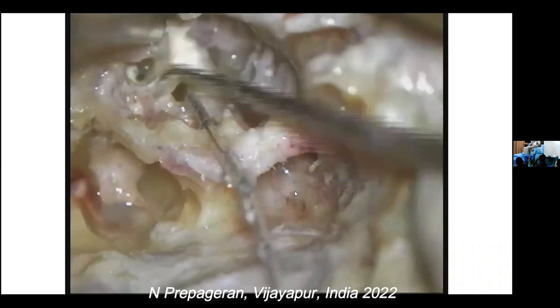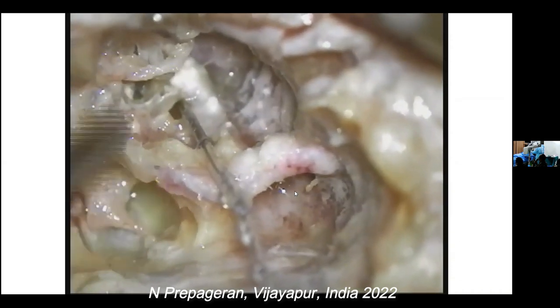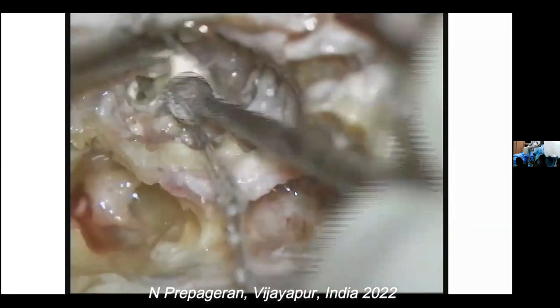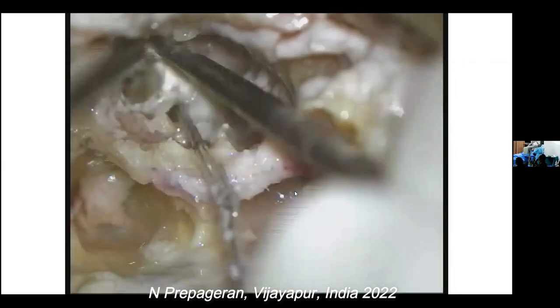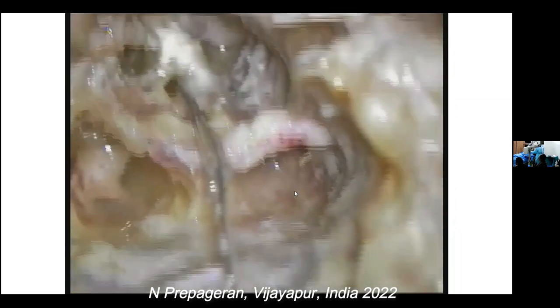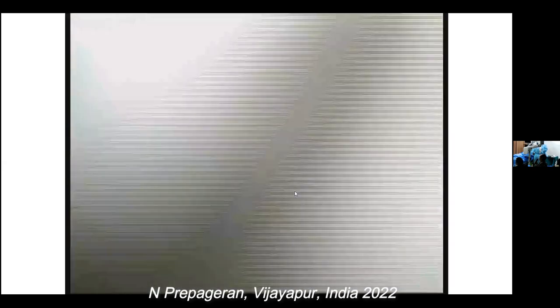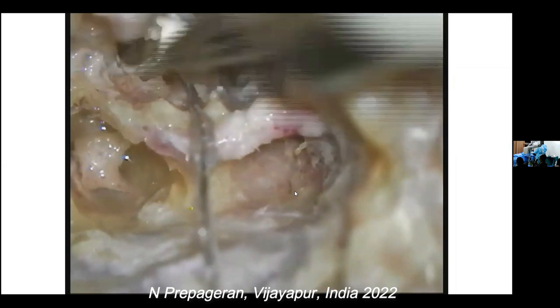Okay. So again, you can see the scala. Oh, this is too short. The electrode doesn't go all the way, no? Yeah, yeah. That's the second turn. Okay, there. That's the second turn. Let's try and see for whatever it's worth. You can see the basilar membrane in your second turn now? Yeah? So let's see whether this can come out or not.